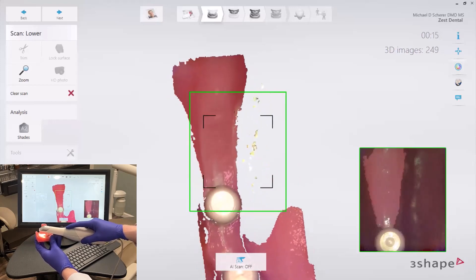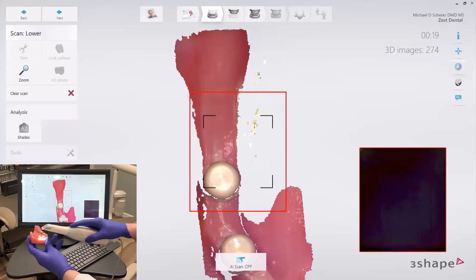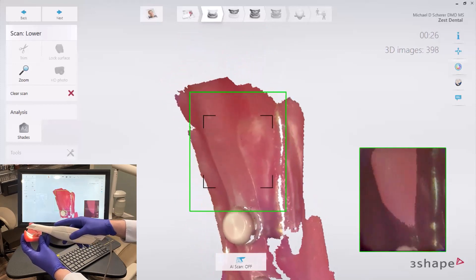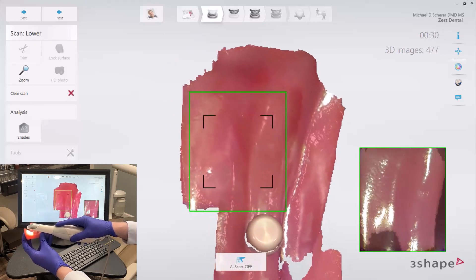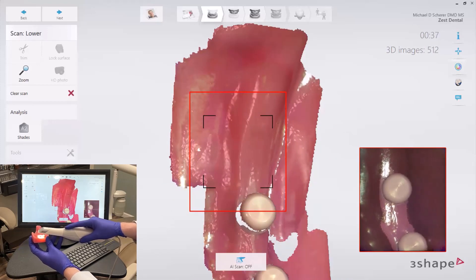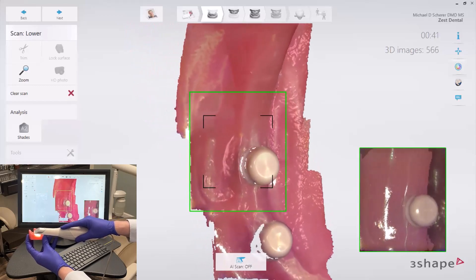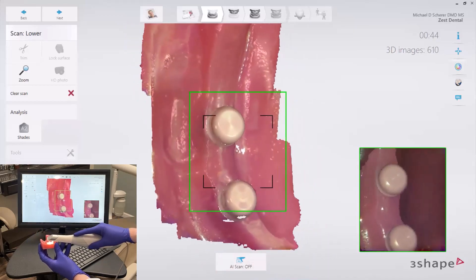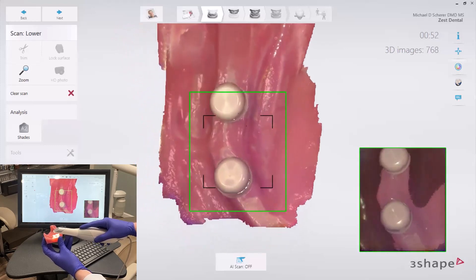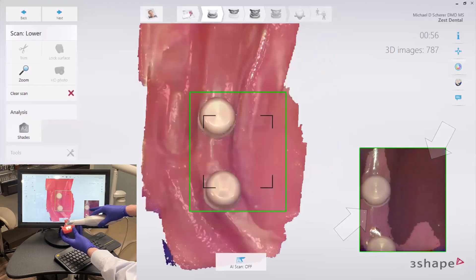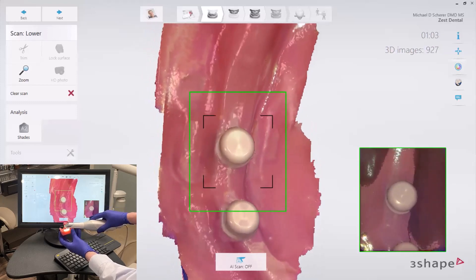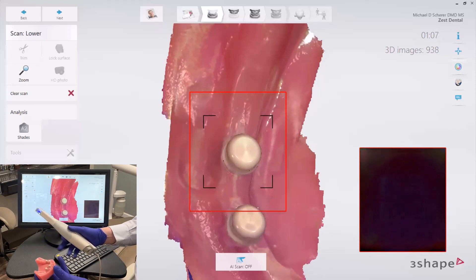Here's where the bounce occurs. If I get lost, I'm going to keep my eye on the screen. As I'm sliding across, I'm going to bounce, picking up those soft tissues as I go. If the patient moves the tongue, I pull away for a second, then go back in and get that shadow to appear right on top of my locator abutments, then swing around, hovering, bouncing back and forth. Any area in the pink portion of the screen is capturing; any darker area is not capturing. So right now I'm only capturing and tracking on the scan body geometry — that coded scan body geometry facilitates this and makes it really straightforward.